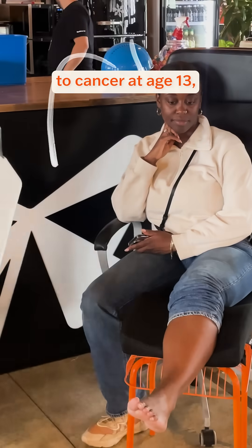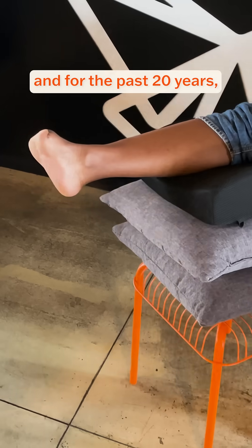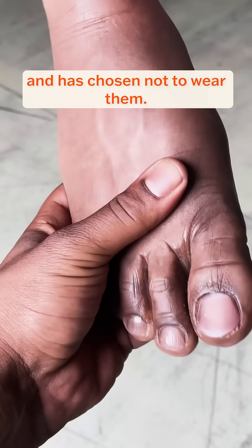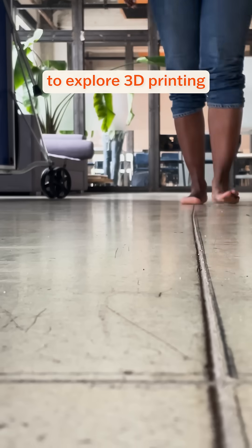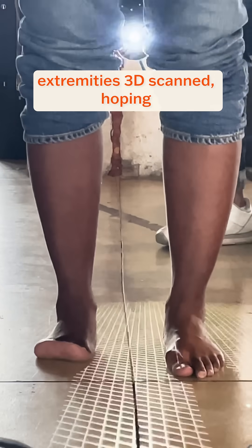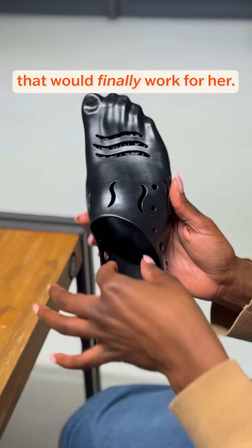This is Sydney. She lost her forefoot to cancer at age 13 and for the past 20 years she's been dissatisfied with her prosthesis and has chosen not to wear them. She reached out to Formlabs to explore 3D printing as an option, so we had her come on site to get her lower extremities 3D scanned, hoping to create something that would finally work for her.